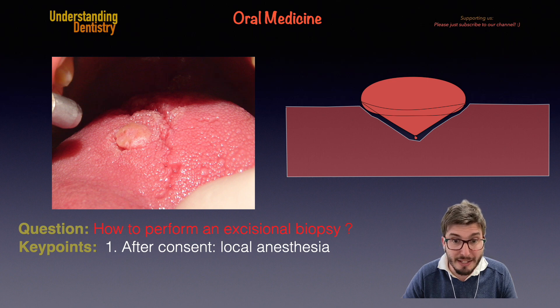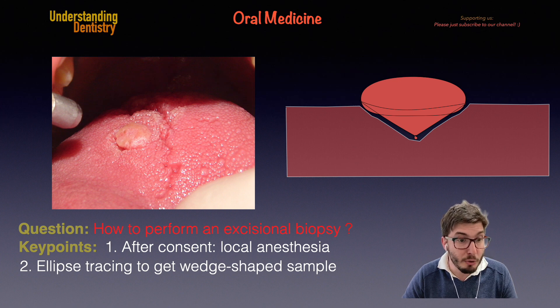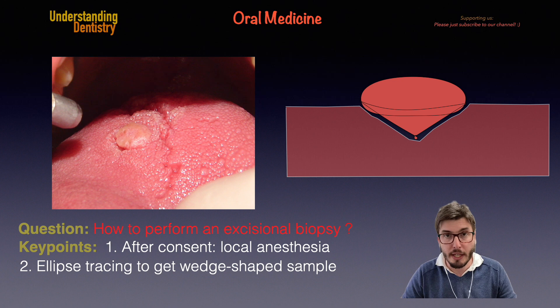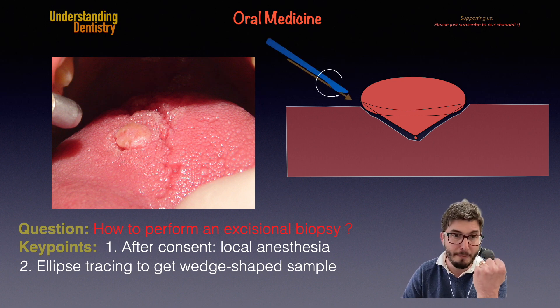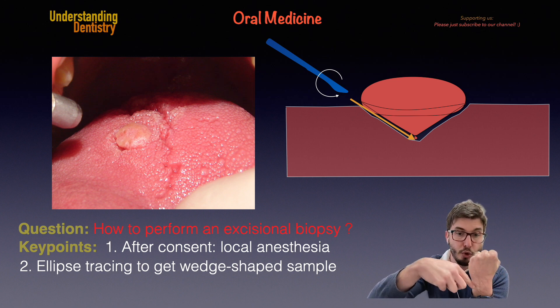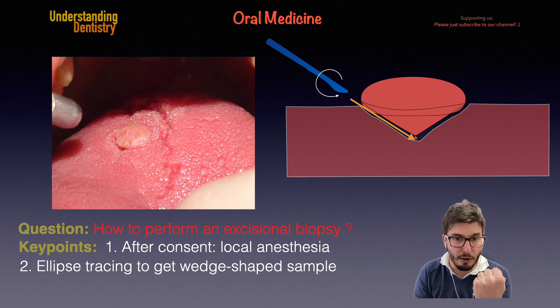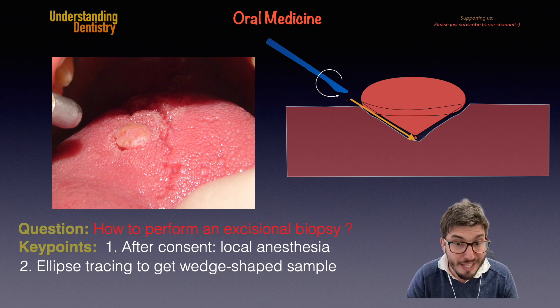The next step is the incision to remove the lesion. You want to have your scalpel blades facing the center of the base of the lesion, then perform an elliptical tracing in order to get a wedge-shaped sample. You will surround and contour the lesion with the blade facing the center — slightly sideways — and perform the elliptical tracing to remove the lesion safely. We don't need to go too deep since it is a small lesion.